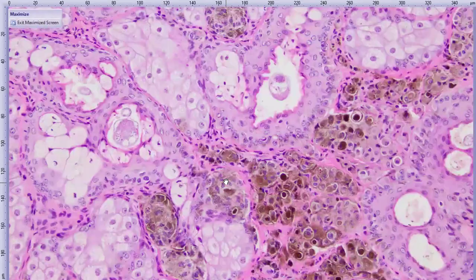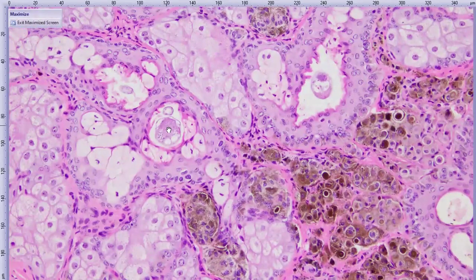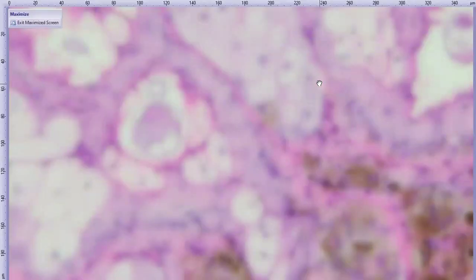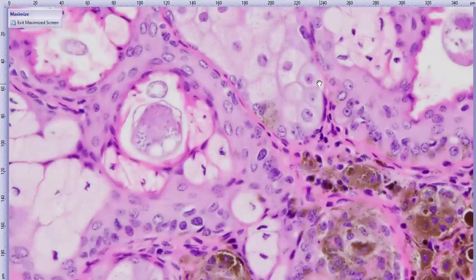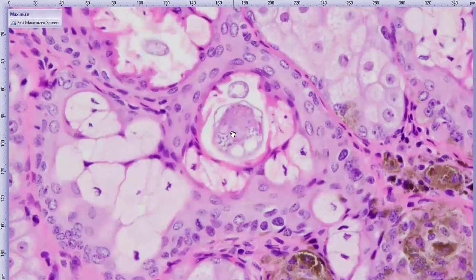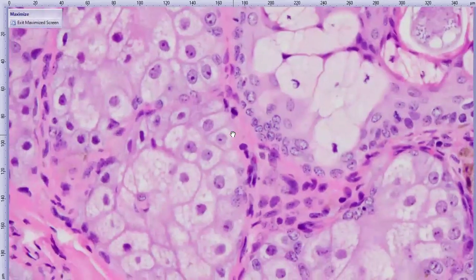And then as we continue to look at this hyperplastic meibomian gland in the ducts here, we have lovely cross sections of these arthropods, consistent with Demodex. So we have a thin chitinous exoskeleton. We've got some internal structures, digestive tracts, reproductive tracts.